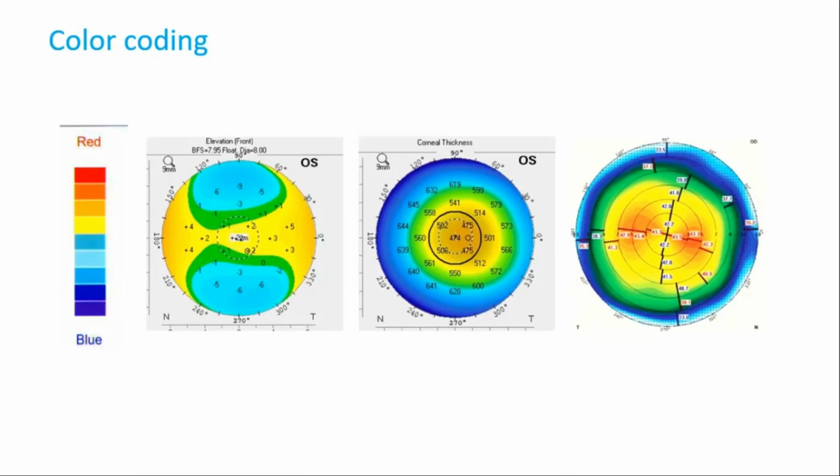And so it is just extrapolating those areas and showing you a color coding. And you can select this to not be seen also. Even on the topographer, the machine is filling in those areas with a color which it thinks is suitable for that area. But actually there is no data captured in those areas which are dotted with blue. On the machine there is a setting in the setup to not extrapolate data, so then it will show all this area as white. Frankly, one must remember that if there are too many dotted areas coming more into the central area, then those maps are not of high quality. So one has to be careful when interpreting these maps.